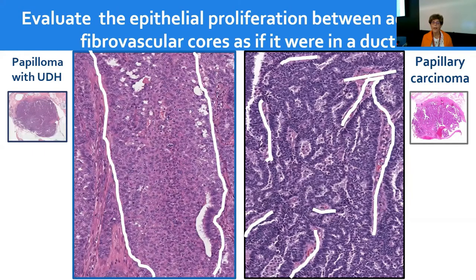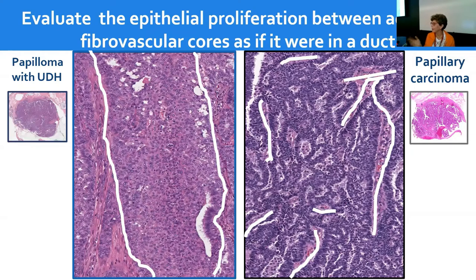The question is how to evaluate the epithelial proliferation within a papillary lesion. Papillary lesions tend to be very busy and can be overwhelming. My approach is simple: I identify two adjacent fibrovascular cores, then evaluate the epithelium between them using the same criteria for UDH, ADH, and DCIS. For example, in this case on the left, the epithelial proliferation has features of UDH, and applying this evaluation in different areas of the large papillary lesion, I diagnosed papilloma with UDH.